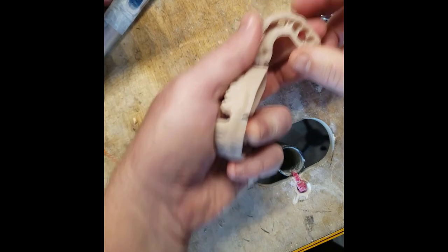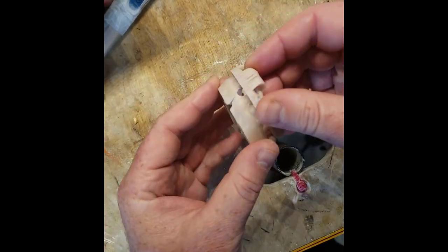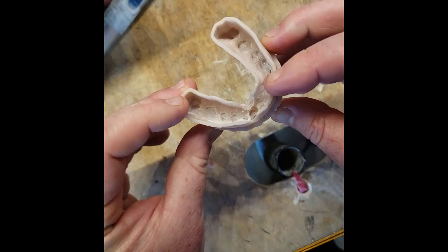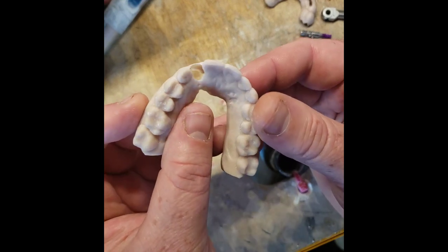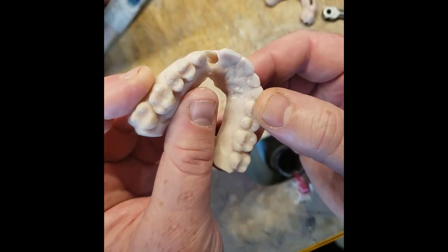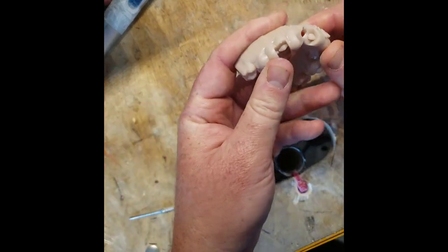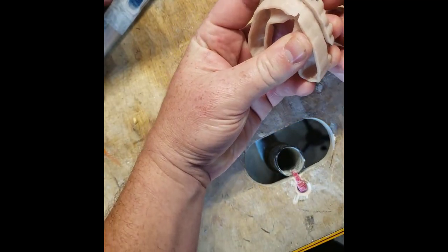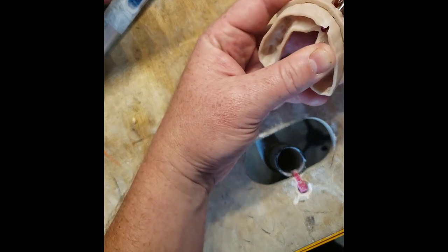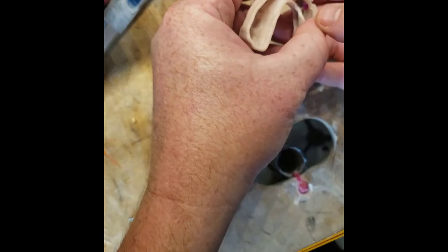I've finished printing the model and the surgical guide. The fit has been verified — everything is fitting together nicely. I actually went back and hollowed the model, because you do want a hollow model. I've taken a burr and made a hole right through where that tooth is going to be, leaving the contacts of the adjacent teeth untouched. Now I can assemble the surgical guide and do mock surgery. No need to drill since we didn't have a solid model — I've assembled an implant analog to the guided driver and seated it down to depth.